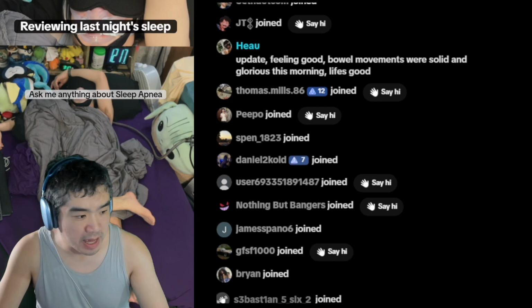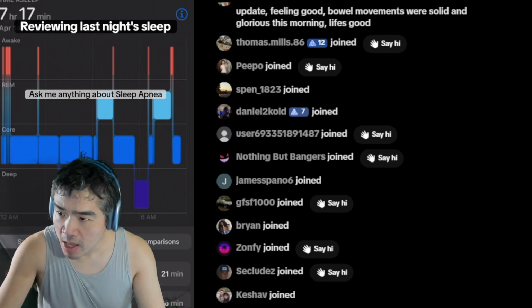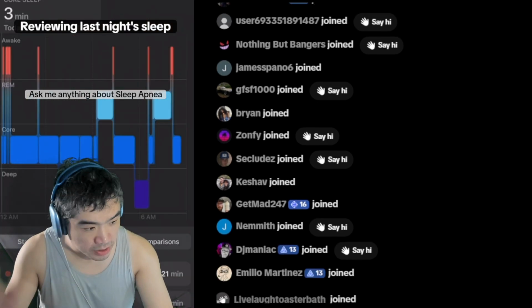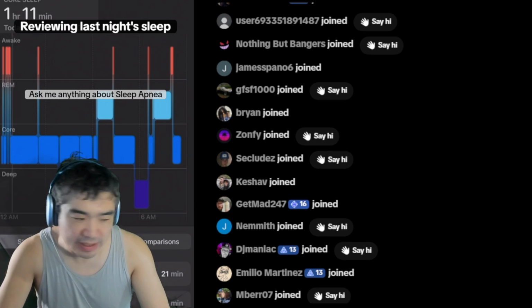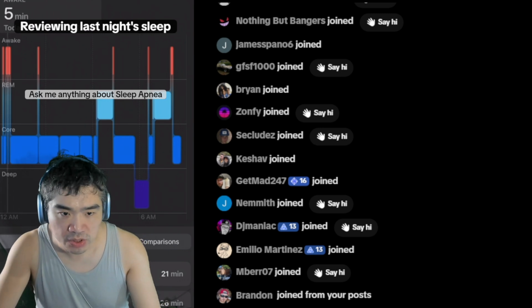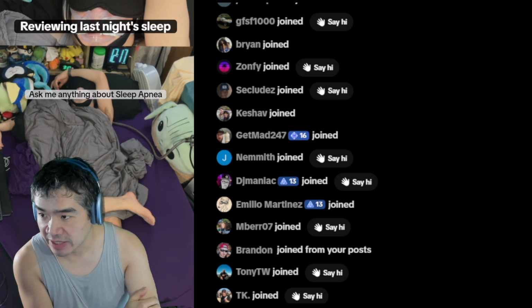So let's go ahead and look at the sleep tracker. Ooh, these are very interesting moments to look at. It said I fell asleep at 12:07. Right now in the recording, it's 12:17. I think a lot of those movements got picked up as me being awake. Even I was a little skeptical whether these were awake movements or not, but I'm pretty confident that most of those movements were me asleep. So let's look at it. It said for the next 5 minutes I'm awake. Let me see if there's any sign of that.